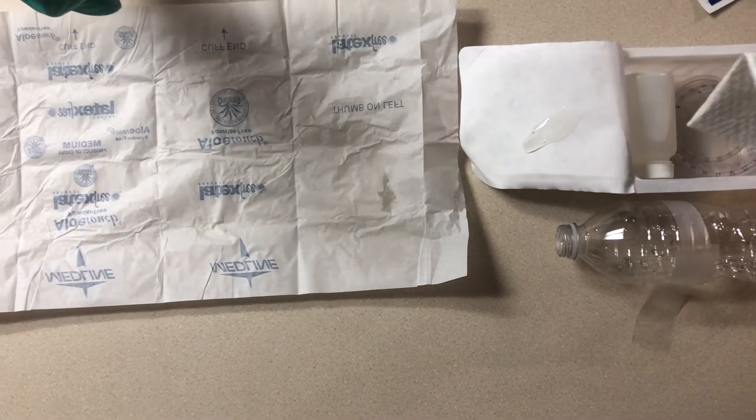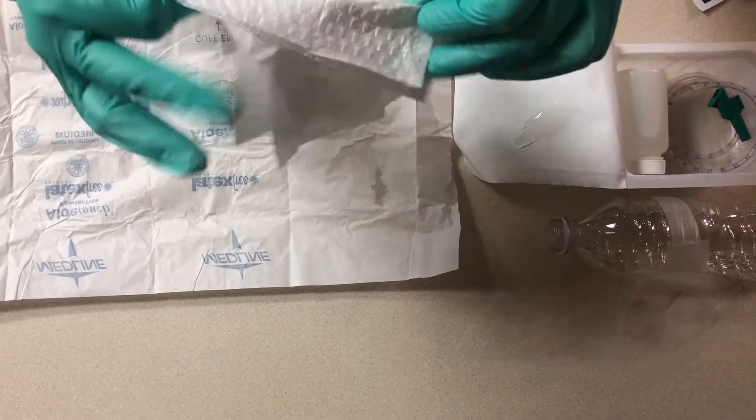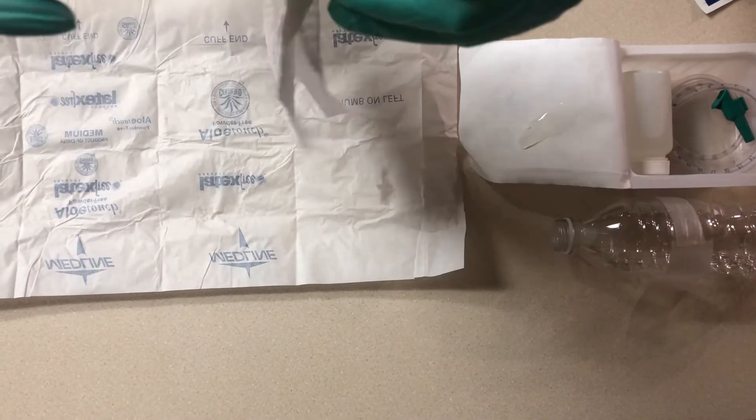Here's a drape. If you want to use it, you'll lay it out plastic side down on your patient's chest.